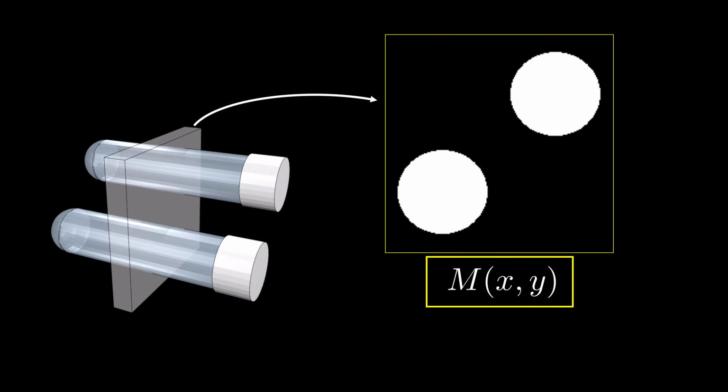The gradient echo is what we call a 2D multi-slice MRI scan. Each 2D image we construct from a single slice has its own 2D K-space to be filled and Fourier transformed. Now let's actually examine the 2D map of magnetic moments in our slice. Here's a collection of spins immediately following excitation and slice refocusing.